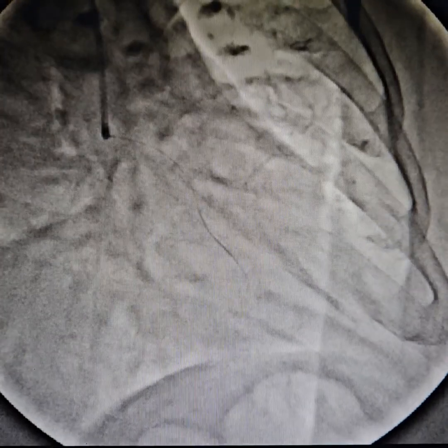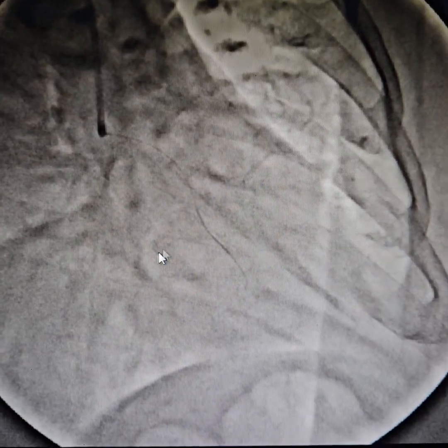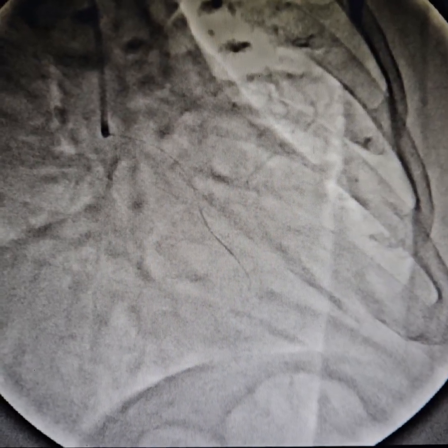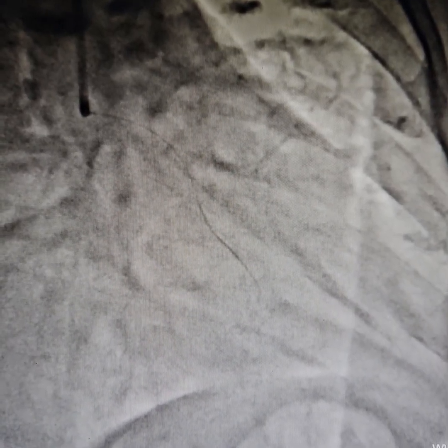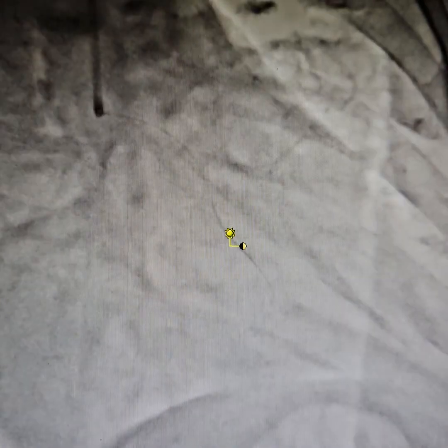What we did is we wired the artery — you can see the wire here. We used extra backup support for the artery and wired the culprit artery, the obtuse marginal artery.